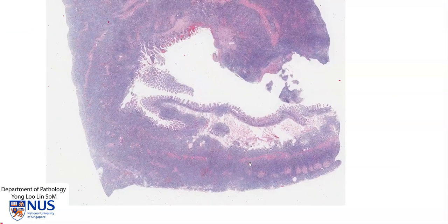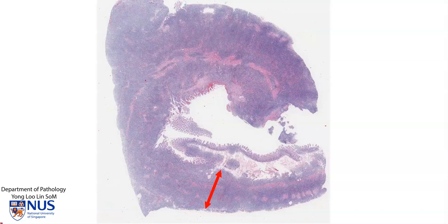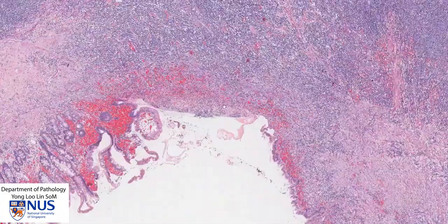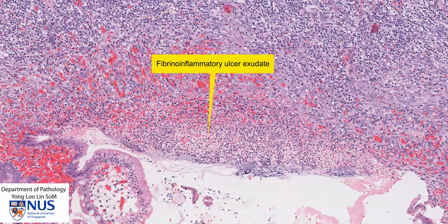We can see that there is a very abnormal infiltrate of bluish-appearing cells throughout the wall of the small bowel. In some areas it is full thickness; in other areas it just involves part of the wall. In this area, we can see that this has caused ulceration of the mucosa. There is a fibrinoinflammatory ulcer exudate here, and this means it can give rise to GI bleeding.